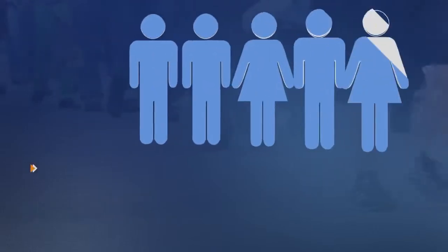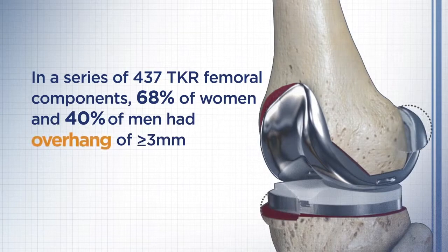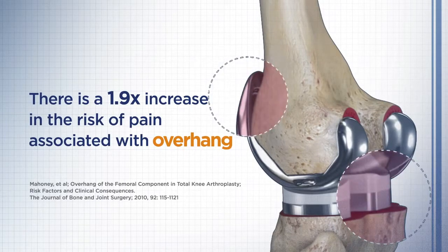With a standard knee replacement, an enormous number of patients are unhappy. They may be unhappy not because there's been a complication. It may be uncomfortable. They may have insufficient function, not able to do the things they want to do. If the implant overhangs the bone, then the muscles and tendons will glide against that metal and cause tendinitis, pain, inflammation. If the metal is underhanging or too small for the patient's anatomy, then they can have excessive bleeding, they can have problems with their motion, their stability.